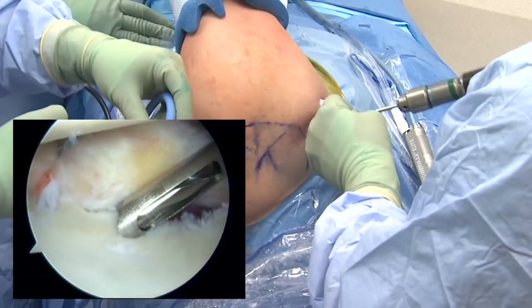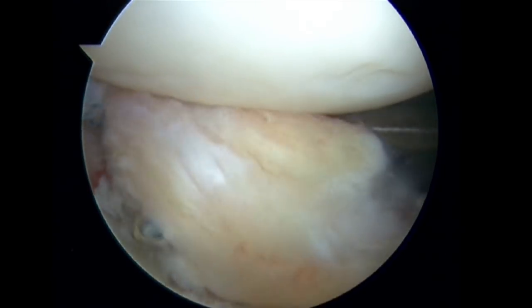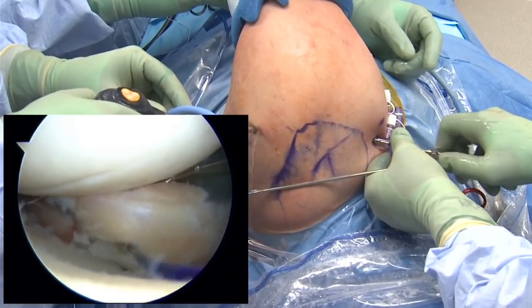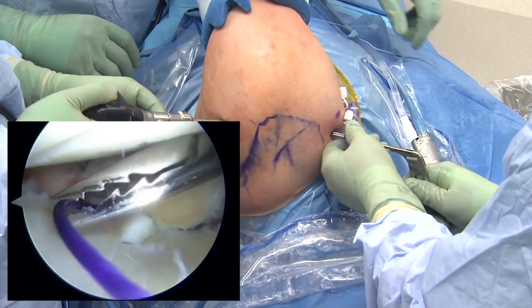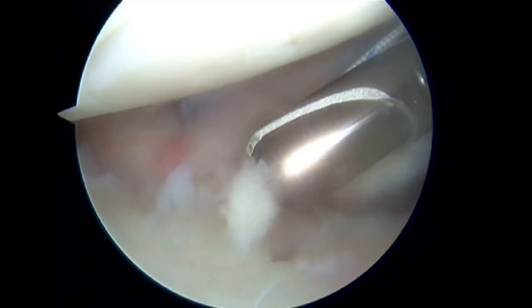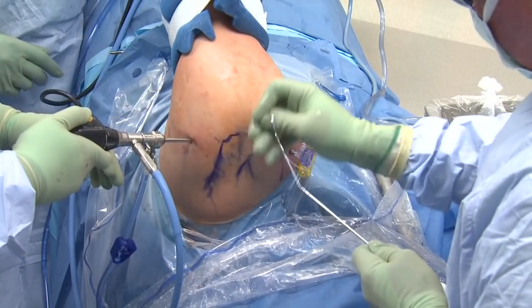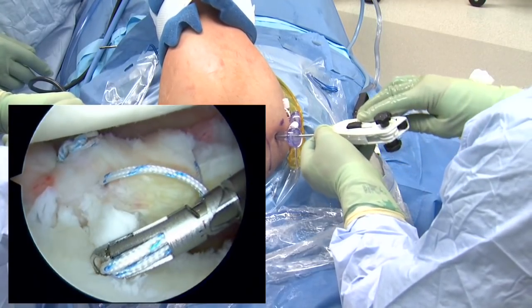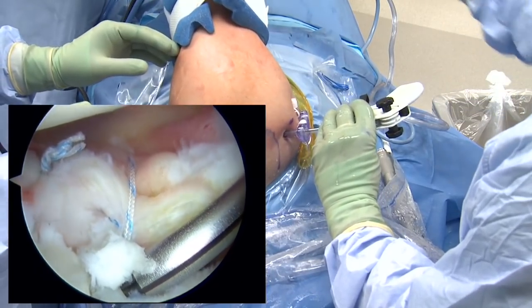We're next going to demonstrate a device where we insert through one cannula and suture it down without any shuttling. We pass our PDS suture, this time pulling a lot into the joint, then pull our device back to the tissue and grab what we pulled through so we have two arms of PDS coming out of the cannula. We then shuttle a suture through the tissue. At this point, we have a hole drilled in the glenoid face and use our device to secure the suture down without shuttling and without tying any knots. We crank this down, insert it into the hole in the glenoid, lock the anchor in position, tap it down, and crank down to secure the tissue through one cannula. There are several devices on the market that allow this.